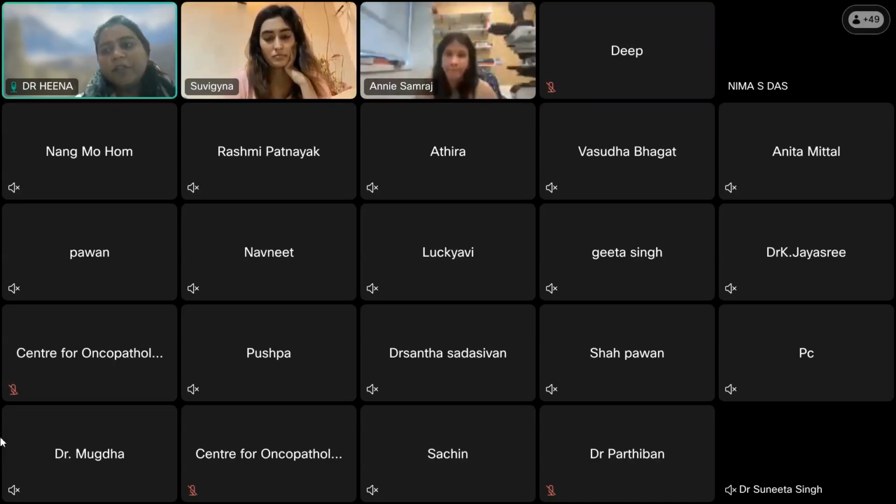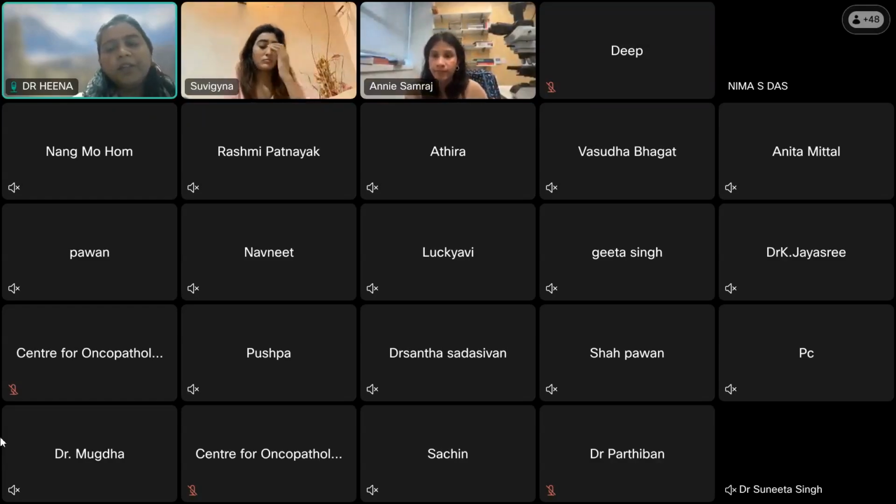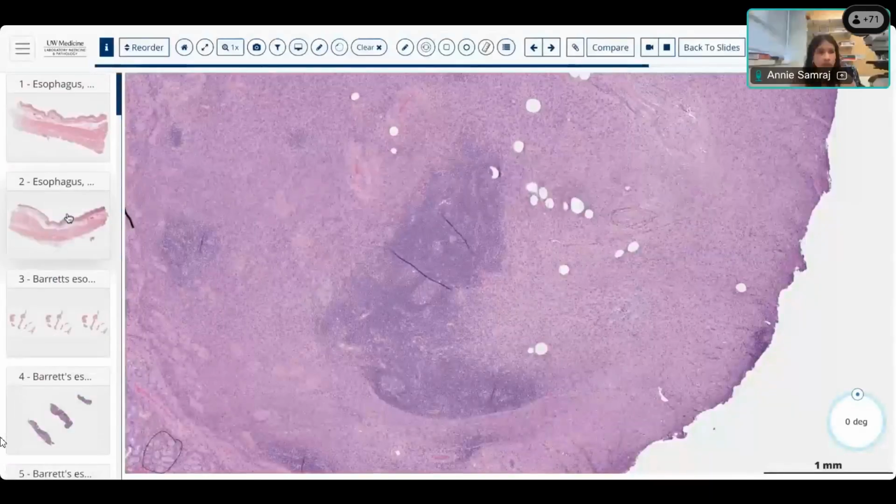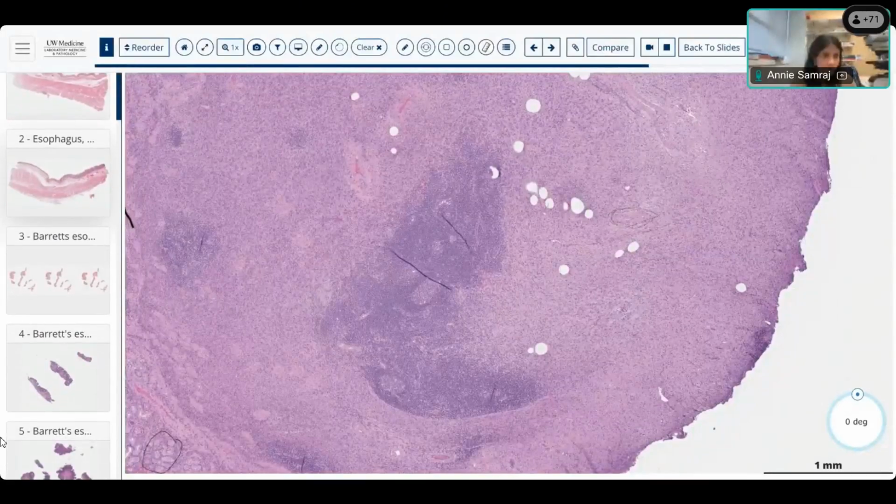One more question: sometimes the regenerative epithelium shows atypia. How to differentiate it from dysplasia? Okay, let me actually share this.